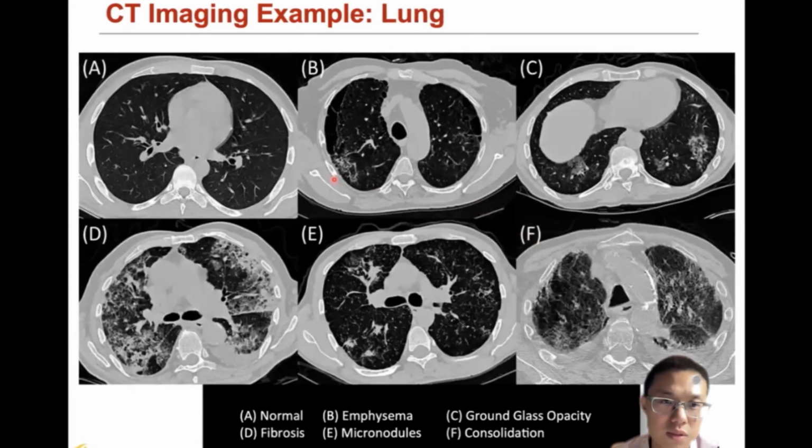And we can also use CT imaging to examine different lung conditions or diseases. So these are different conditions or diseases of the lung. I think these images are very clear for radiologists to make the diagnosis.